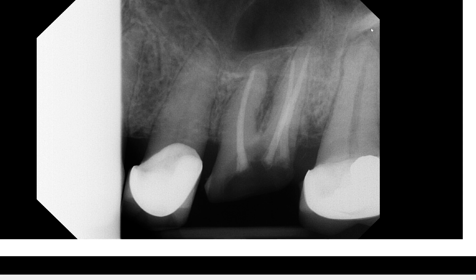We are going to take a look at how this area appears in cone beam CT, as well as the floor of the maxillary sinus. Let's try to follow the floor of the maxillary sinus as best as we can.